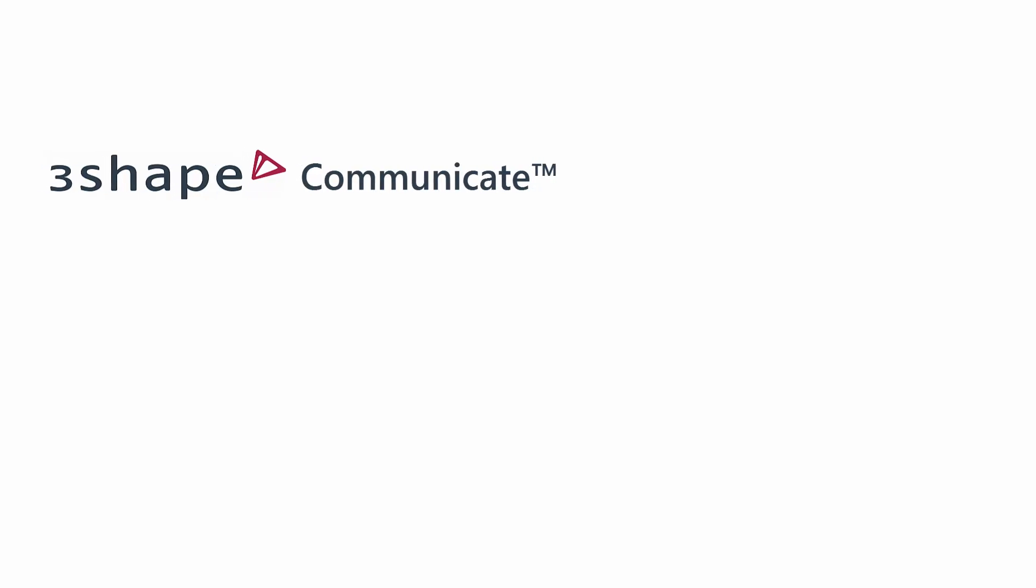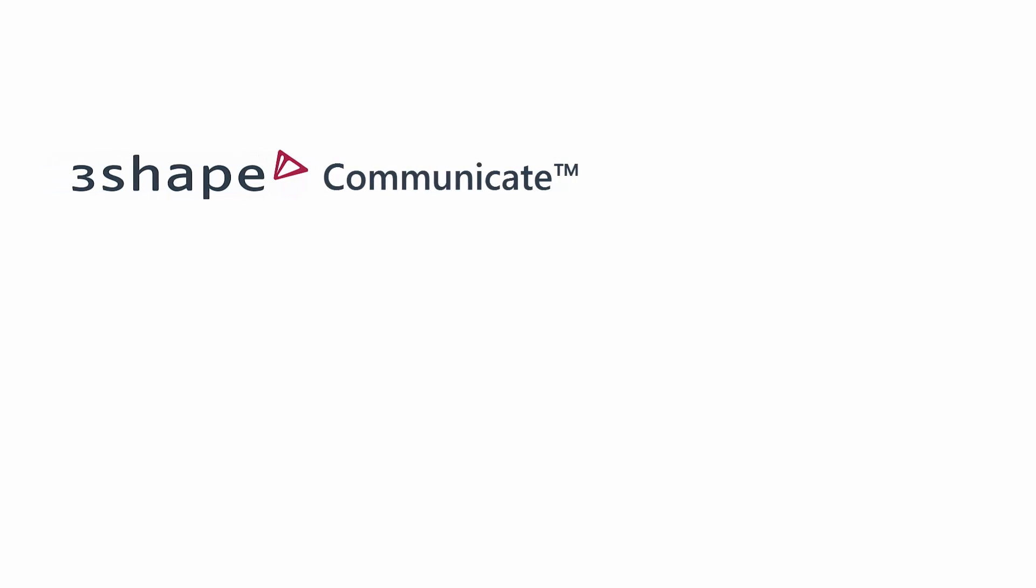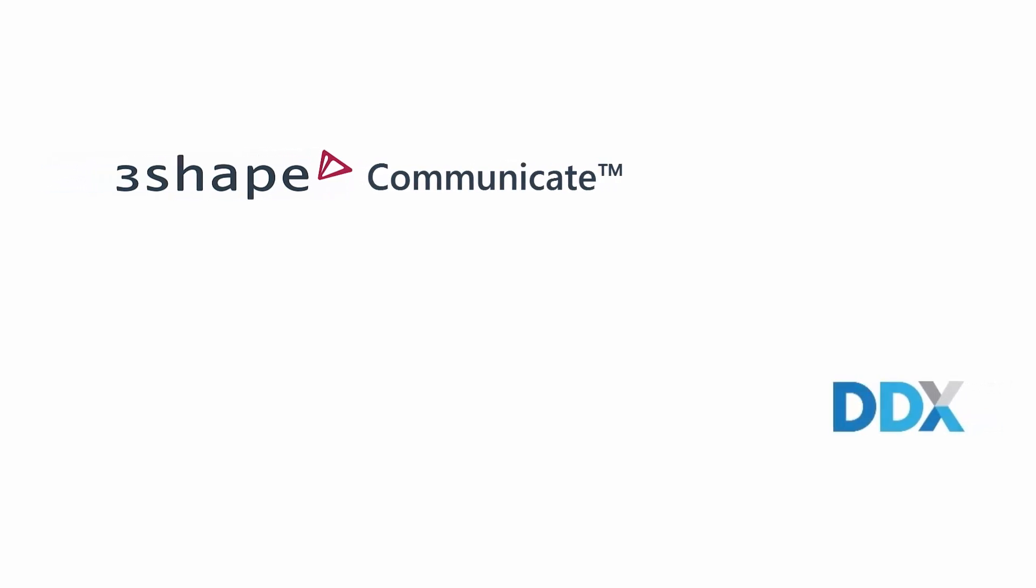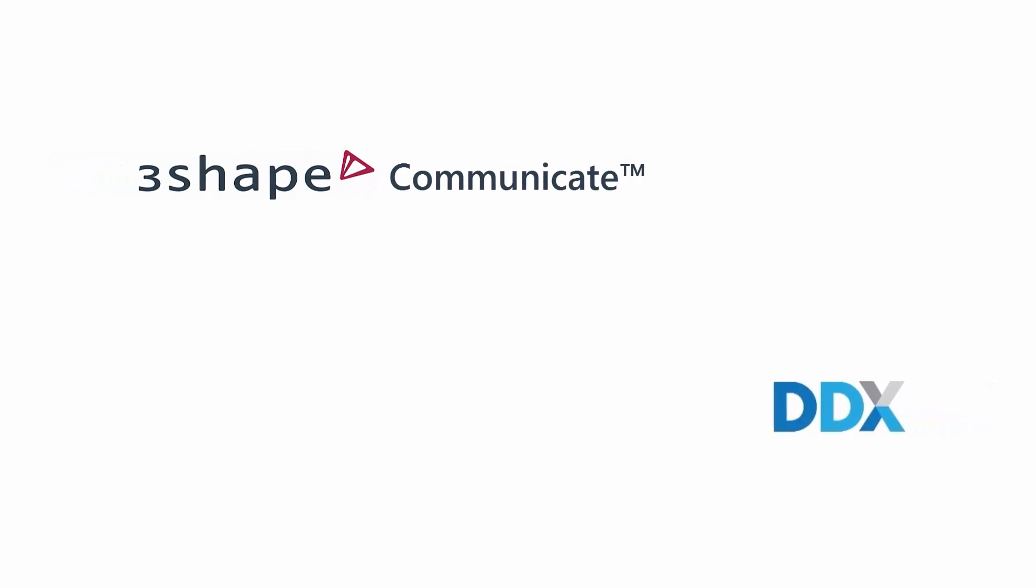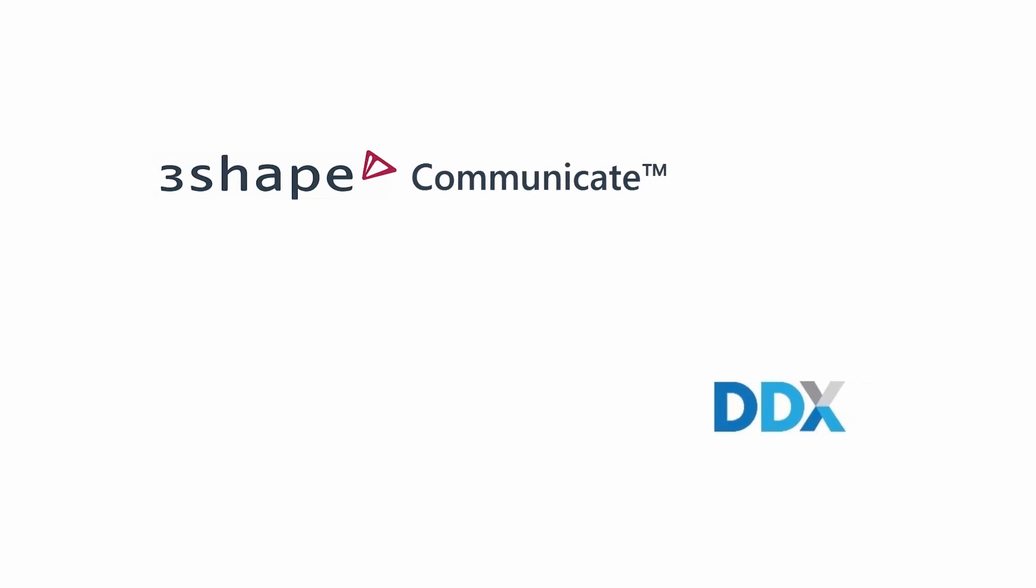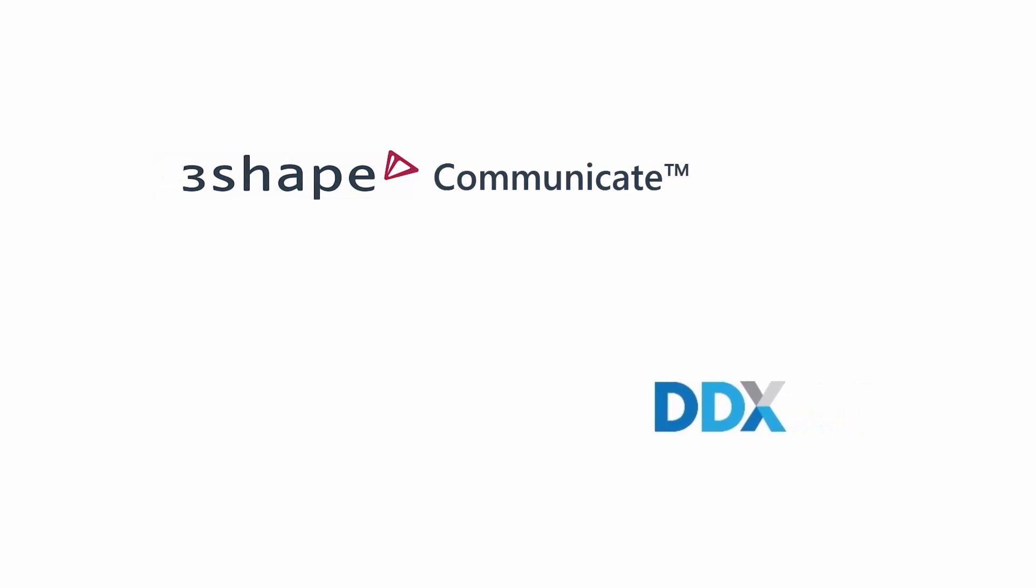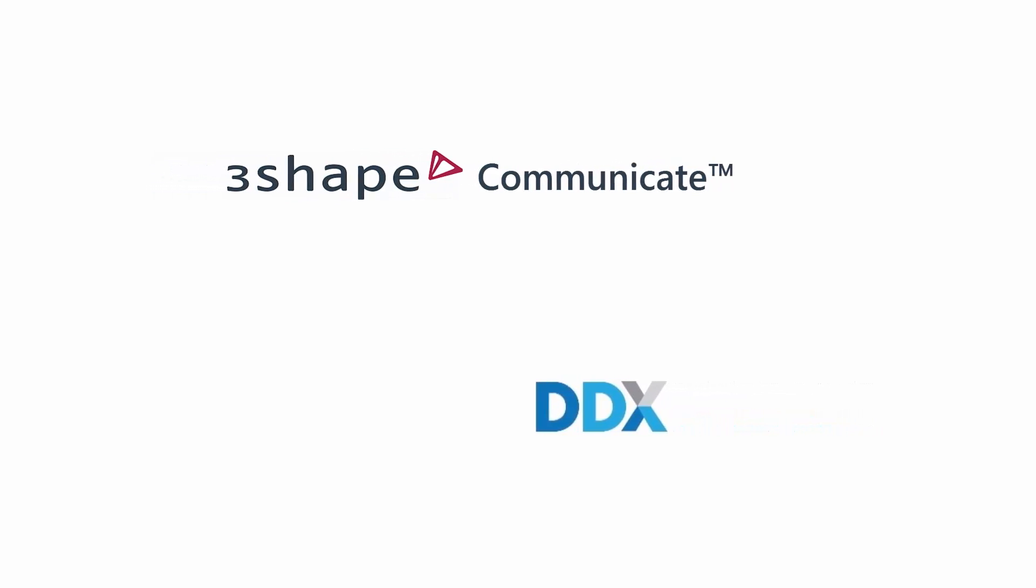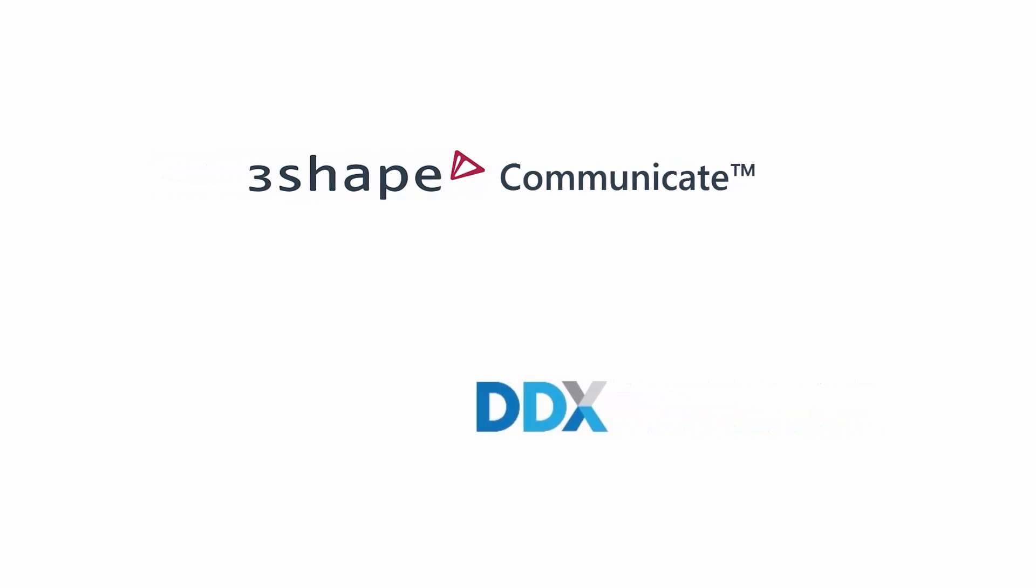Furthermore, the practice needs to have a 3Shape Communicate account integrated into Trios and a DDX account to which their labs are associated. You are now ready to set up the integration.